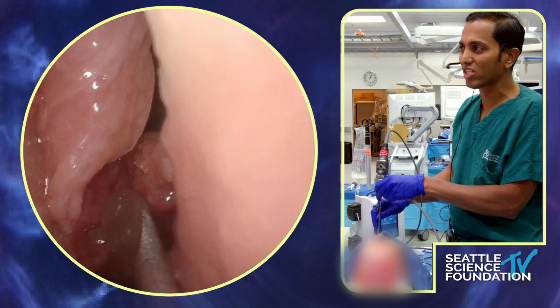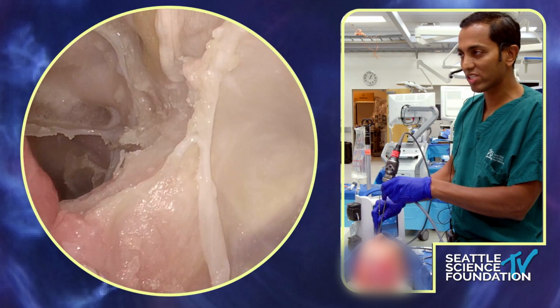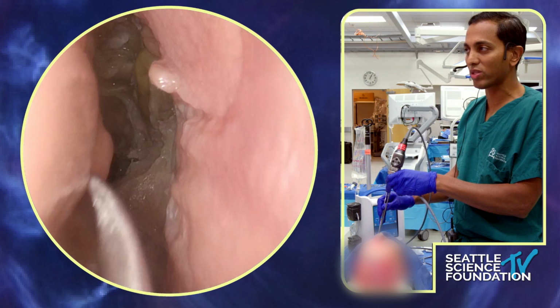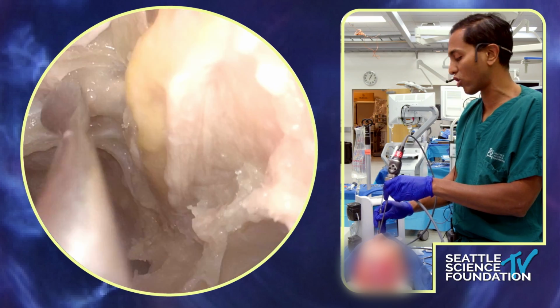Again, these cadavers, none of this mucosa does very well, so you tend to kind of use it like that. But then what you can do is whatever size you want this flap, you can make it much longer, you can elevate it up and lay it over there. Again, I made it much smaller. We didn't want to mess with anything. We've got the drill coming up. But essentially that flap, you can elevate it up, and with the right length, it'll just lay right over there.